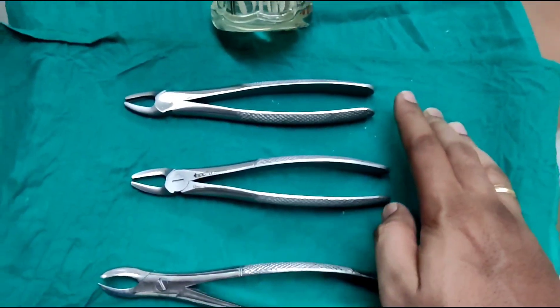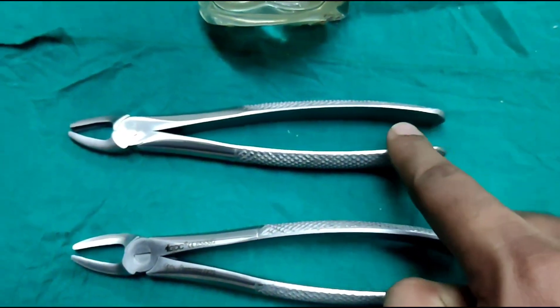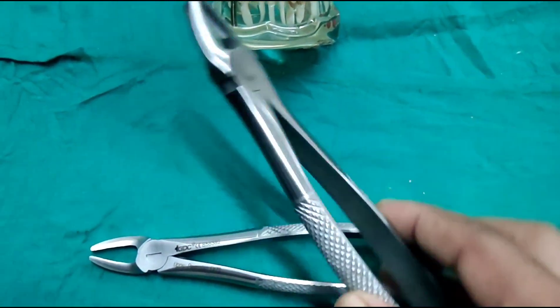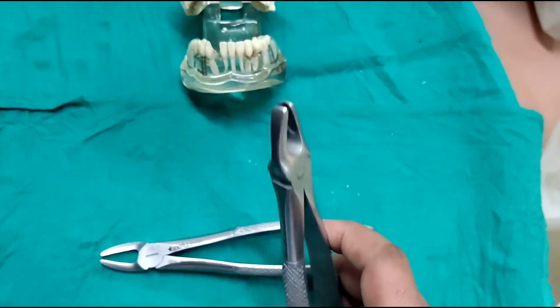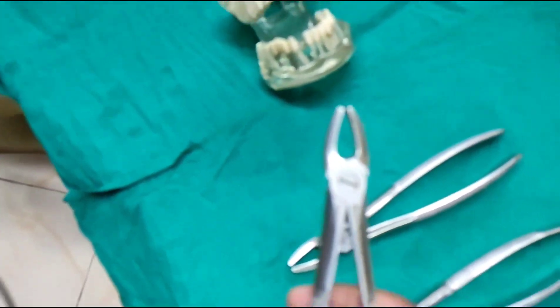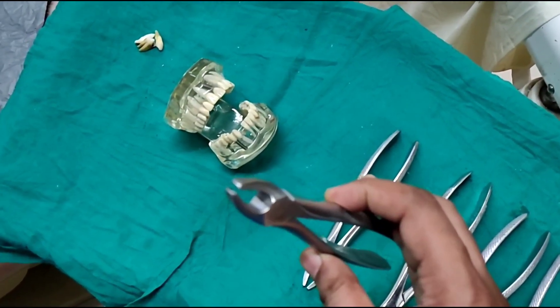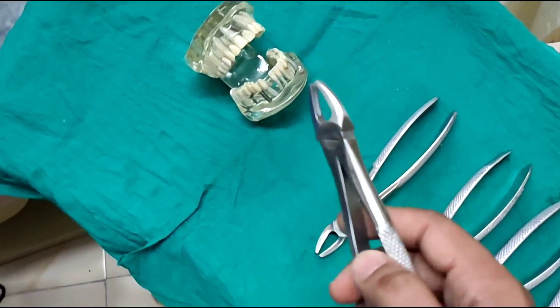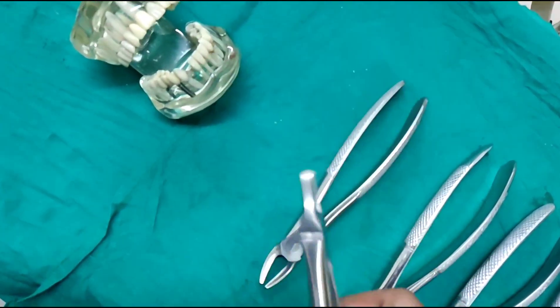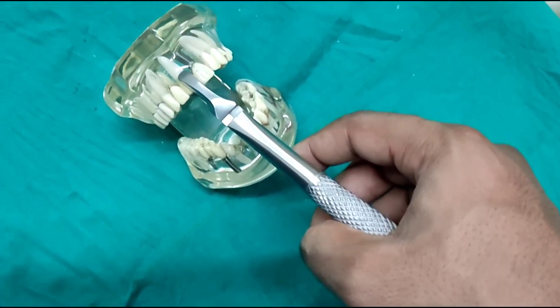Coming to the parts of the extraction forceps — just to revisit: this is the handle, the hinge, and the beak. So the anterior forceps is straight; the beak of the forceps is straight. In comparison to the mandibular anterior forceps, the tip of the beak is not attached to each other — there is a little spacing in between the tip of the beak. This is because the maxillary anteriors are a little bit thicker labiolingually in comparison to the mandibular teeth. This is how we engage the teeth in the maxillary anterior tooth.